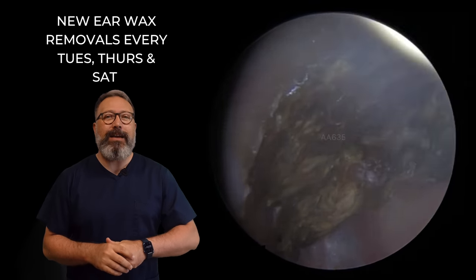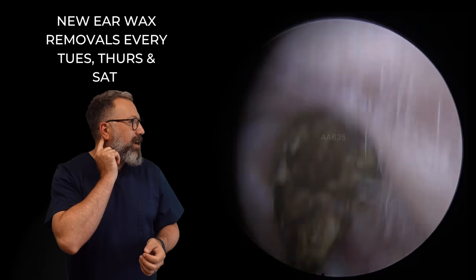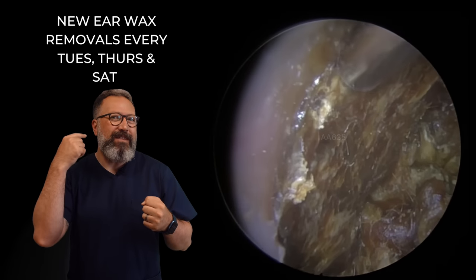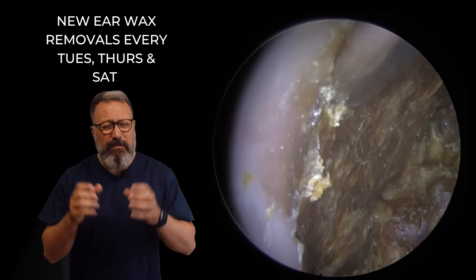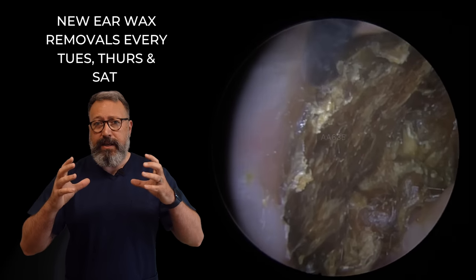This lovely gent came through. He has a mastoid cavity. Now, if you don't know what a mastoid cavity is, basically it's where you have to remove part of the mastoid bone back here. What that does effectively is widens out the ear canal. It's usually post something called mastoiditis, where you get infection in the actual mastoid bone itself, so it has to be surgically removed. It's a very painful condition, quite an extreme case, but what you end up with is a very wide ear canal.